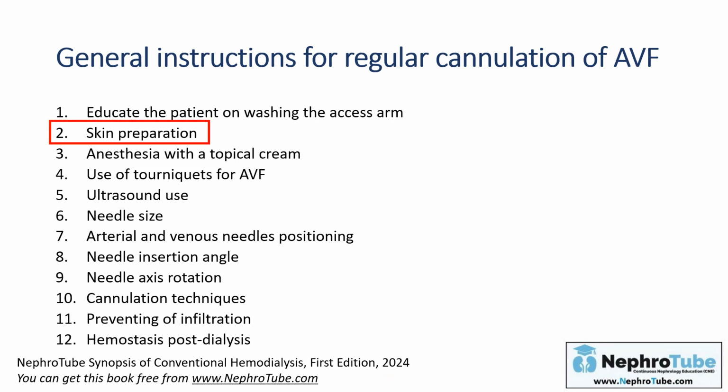Also, skin preparation should be done by aseptic technique, and this is very logical. In some patients, anesthesia with topical cream can be used, however, it is rarely needed. In patients with high pain sensitivity, you can use topical cream with anesthetic effect, so the patient cannot feel the painful stimulation of the needle.